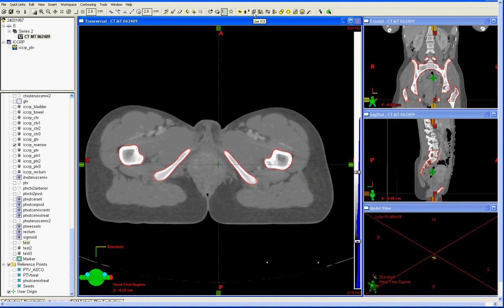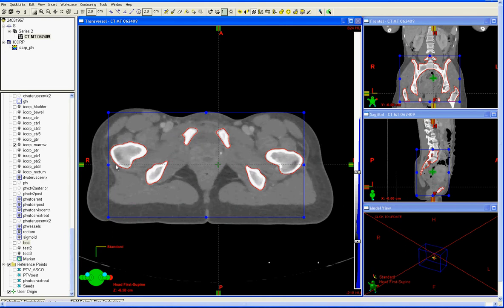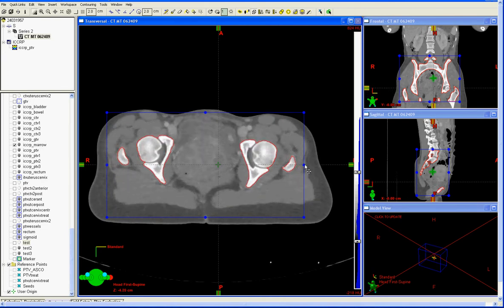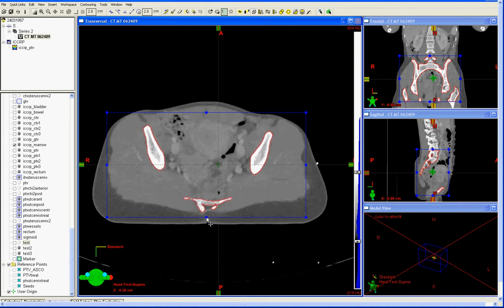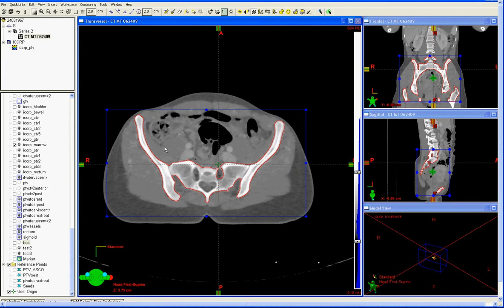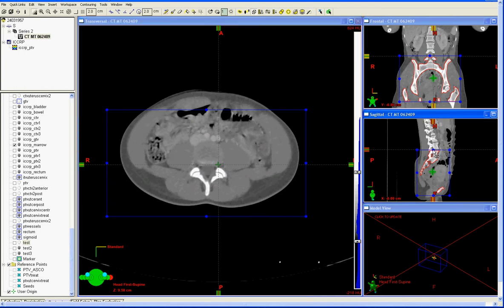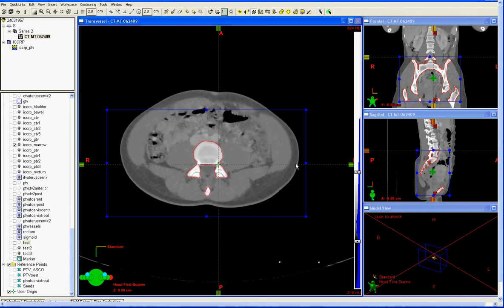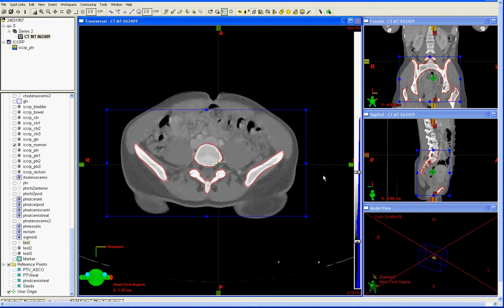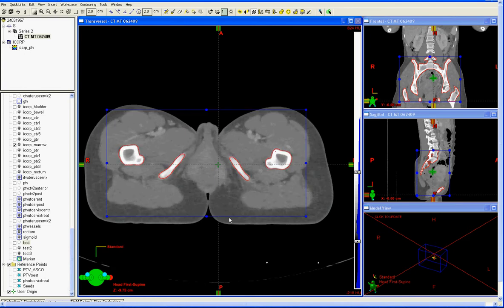The first step is to define the volume of interest that will encompass the bone. Clicking on this tool should bring up a box, and you can adjust the boundaries of the box to include all of the bone. You want to extend it out laterally enough to encompass the trochanter and the femur. Posteriorly, you need to make sure that the sacrum is in the box, and anteriorly, you want to make sure that the ilium is entirely within the box. Adjust the upper boundary to meet the top slice of the L5 vertebral body, and at the inferior extent it should end at the ischial tuberosity.